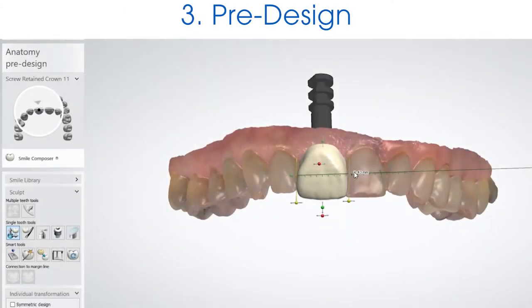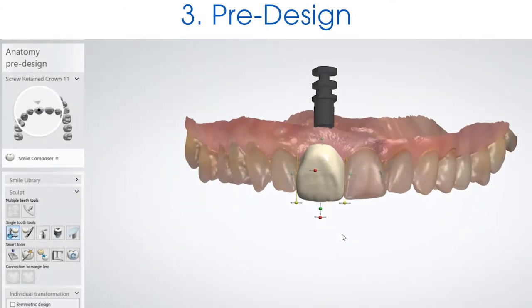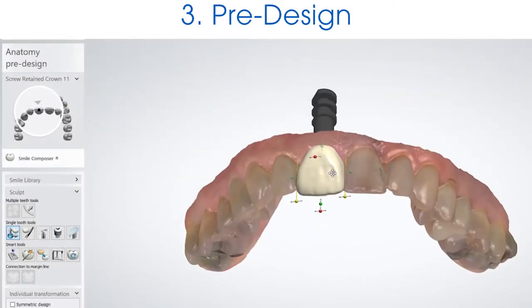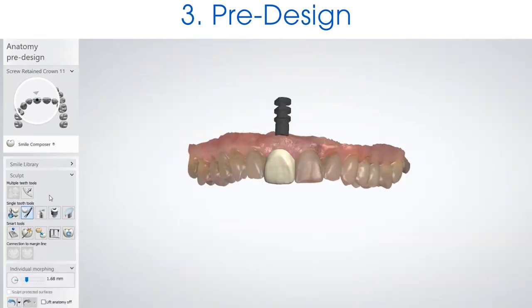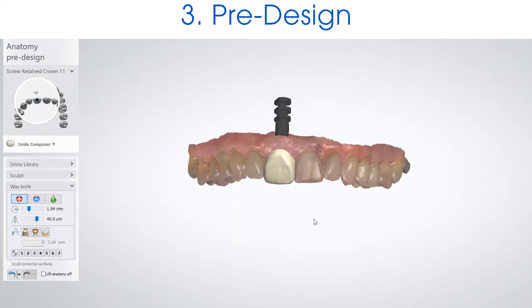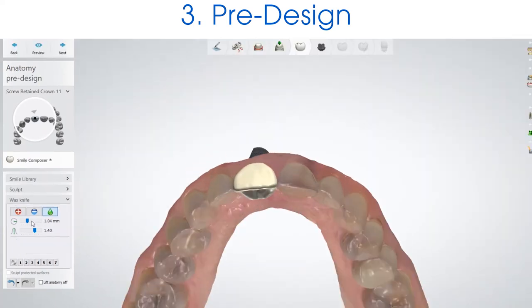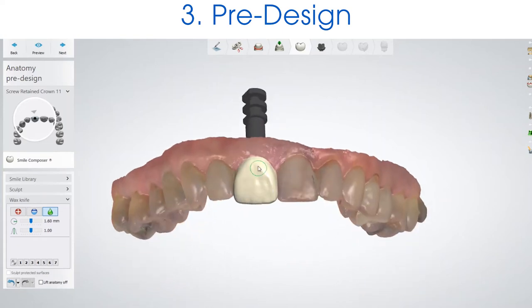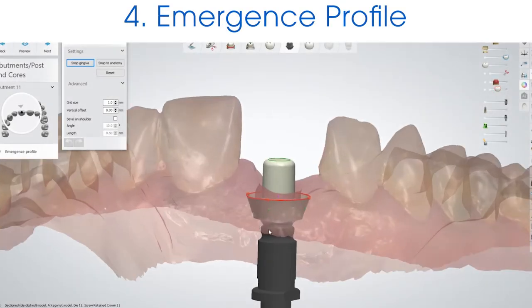Step three is the pre-design step. In the pre-design step, you are designing your crown to size. I usually work from left to right, working in larger movements and then going to smaller movements. I will start with the transformation tool, then the morphing tool, and then the sculpting tool.